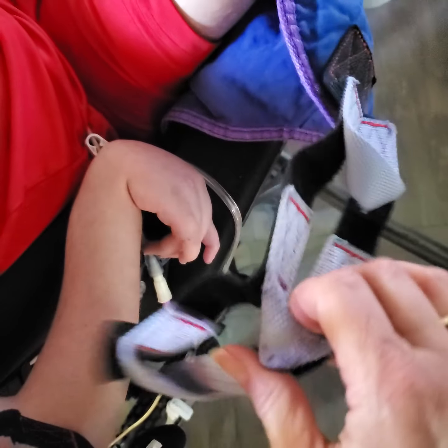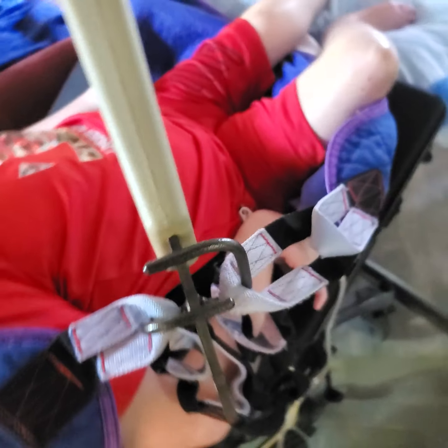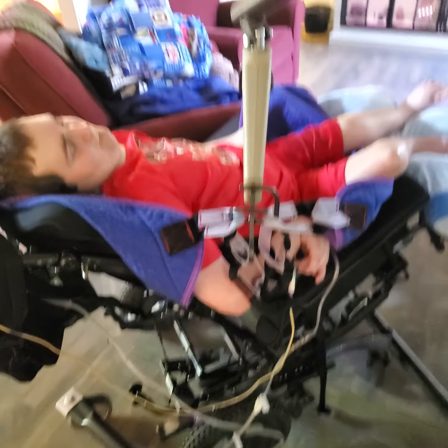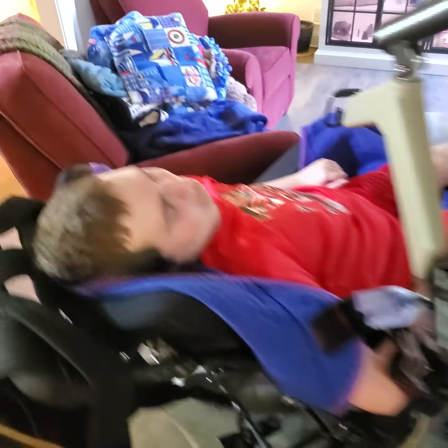Then we're going to take the one on the same side, and we're going to take not the lowest loop, but the second loop, and we're going to hook that into the hook that is pointing towards him. So you can see right now his right side is hooked to the Hoyer lift. Now we're going to go to the left side and repeat that same process.